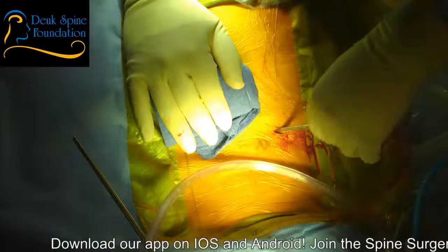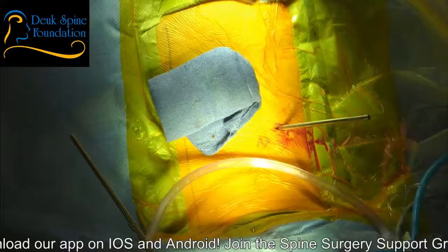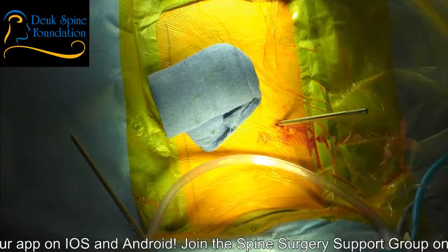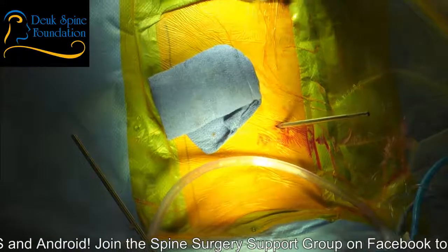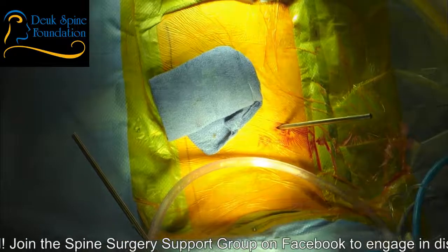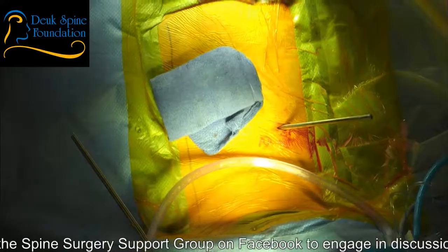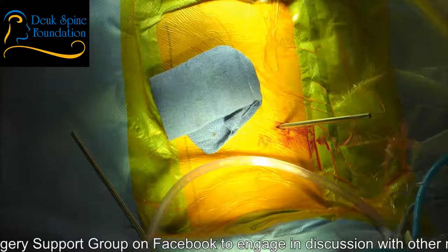Show me the bottom, the sacrum a little bit. I think you're a little higher than I want you to be. Just a tiny bit. Shot. Looks good. There's that pseudo disc. Perfect. I like it. All right, now we can advance the dilator, as long as our anesthesiologist gives us the green light, thumbs up.